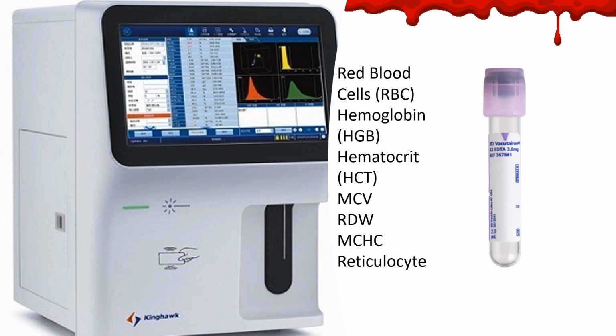So, lo mismo pasa con el hematócrito, el HCT que está en paréntesis. Esto significa que si hoy me dio un porcentaje X, yo no puedo reaccionar a él. Yo tengo que mirar los previos para poder yo diferenciar y decir, este porcentaje que me dio ahora subió o bajó para yo poder tratarlo clínicamente. You see what I'm saying?